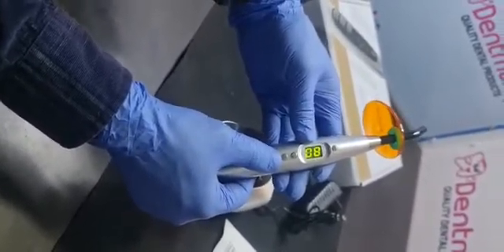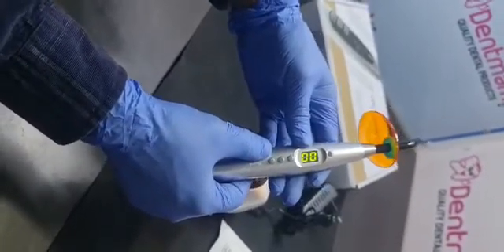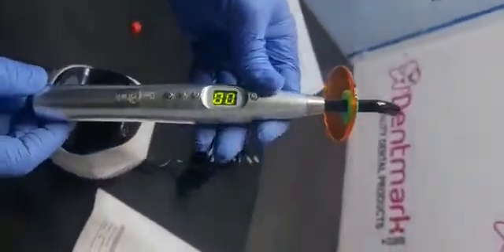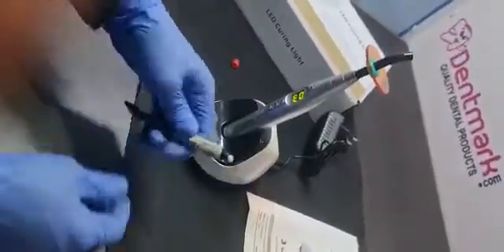You can increase it to 60, 70, 80, 90, and up to 100% intensity. This is very useful. It's a good light cure by Dentmark. I'll show you the demo on this.